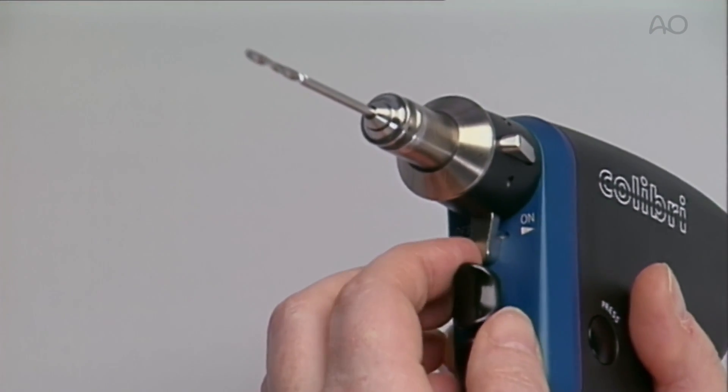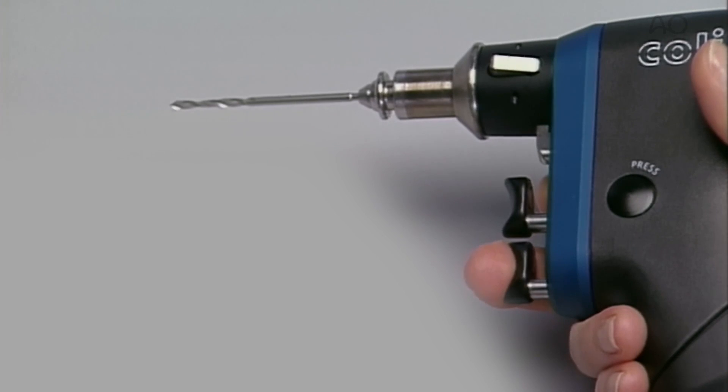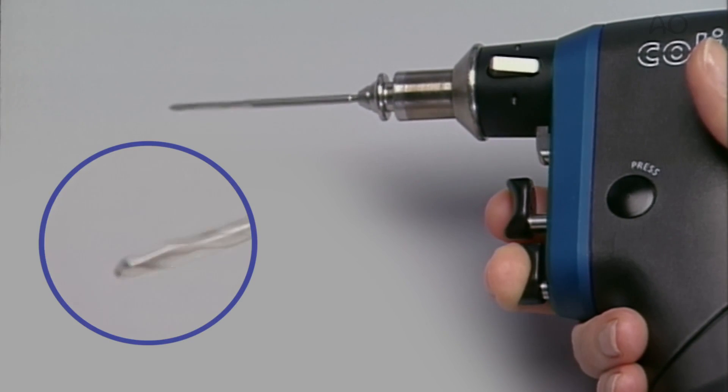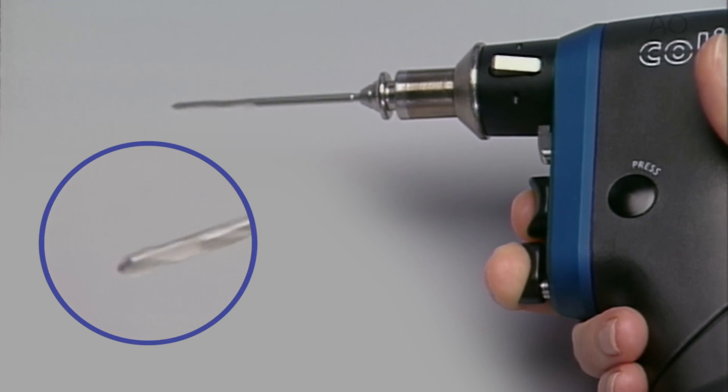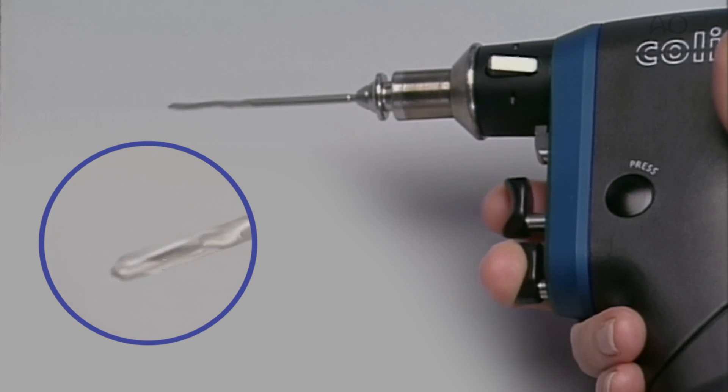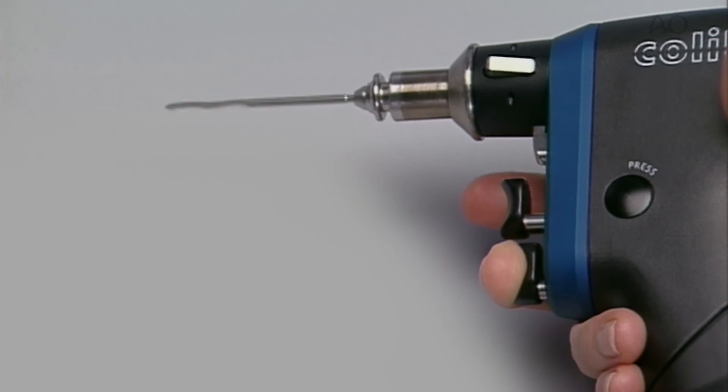The machine is unlocked. By depressing the lower trigger, the drill functions in the forward mode. By depressing both triggers at the same time, the reverse mode is engaged. The speed of the machine can be regulated by the amount of pressure on the trigger and it stops instantly when released.